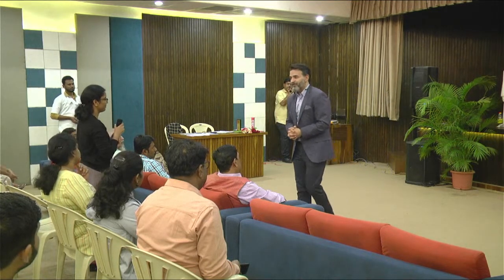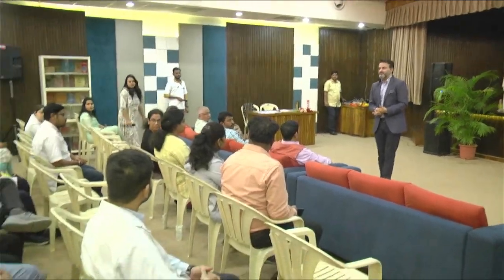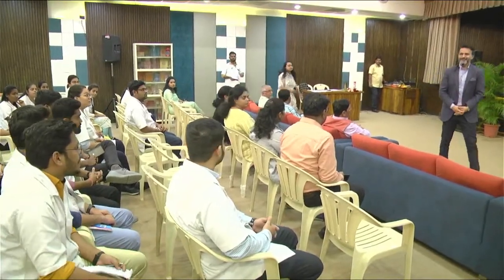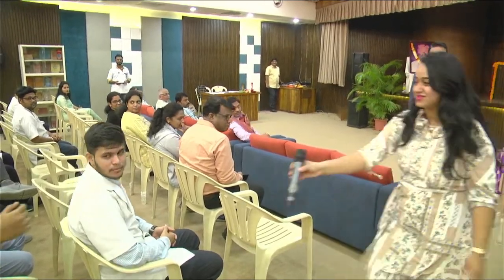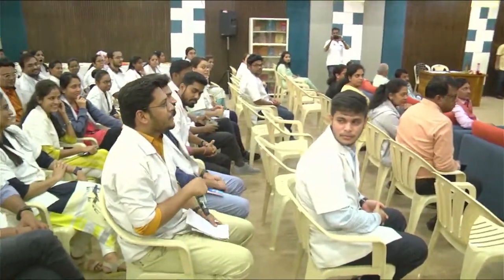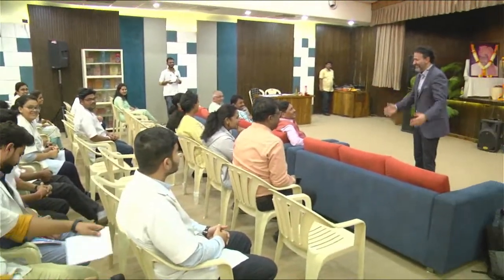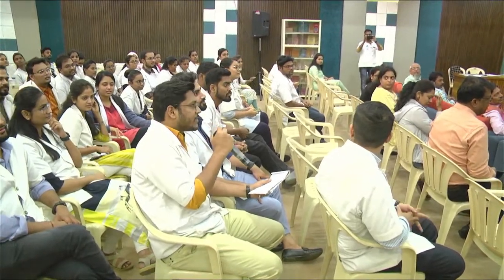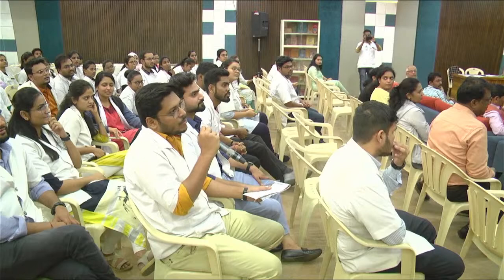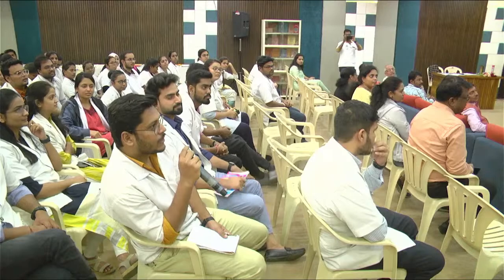Okay. Thank you, sir. I thank you for the question. And another question. Good afternoon, sir. My question is related to some clinical aspects, sir: what is the cost of that guide, and where in India are they making this, and how much time does it require if we give an impression? And my second question is, are these guides useful?